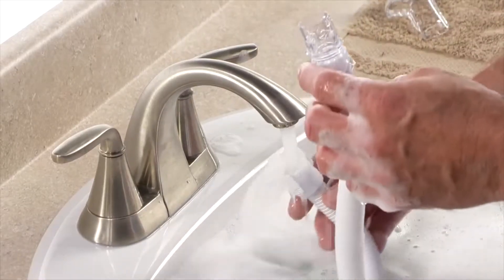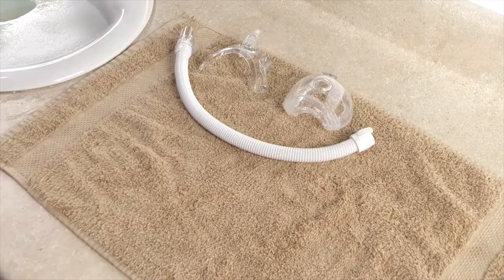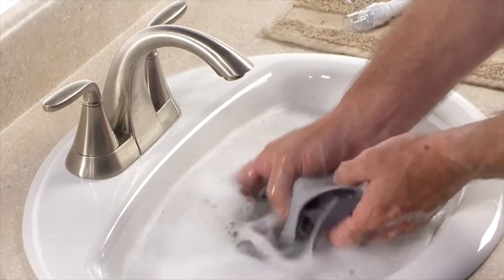Rinse the parts thoroughly with water and air dry completely. Be sure the mask and tubing are dry before use. The headgear should be washed weekly or as needed.